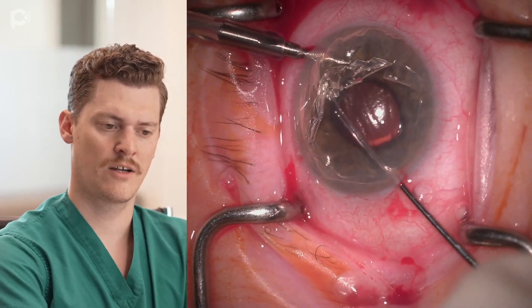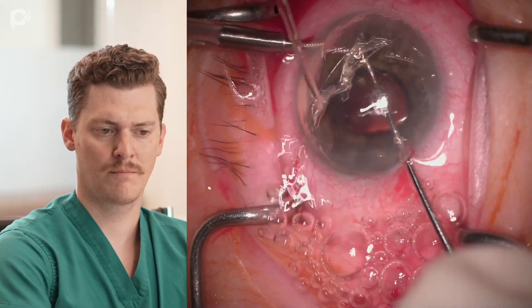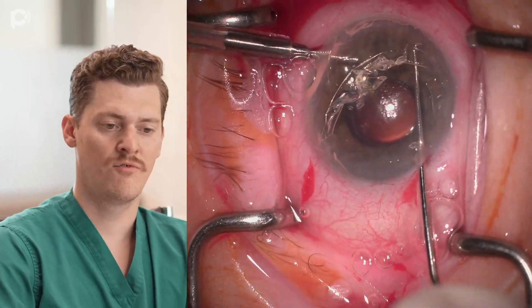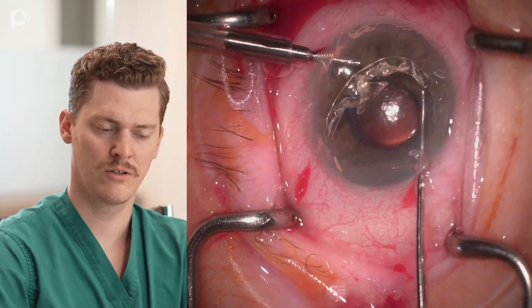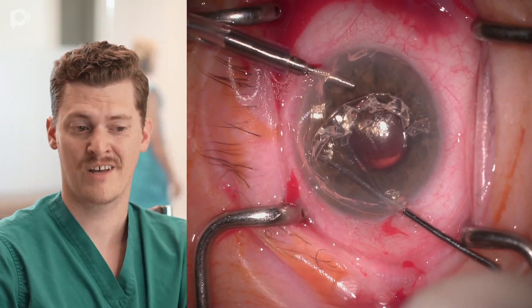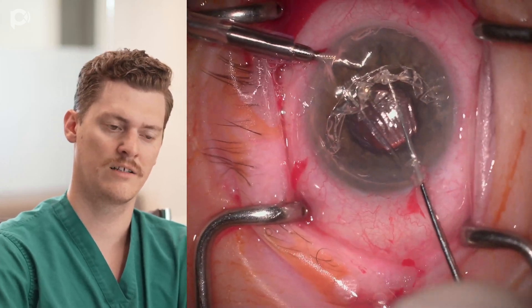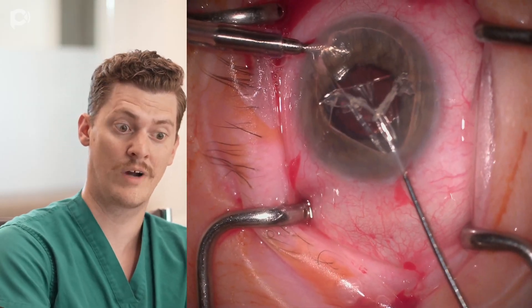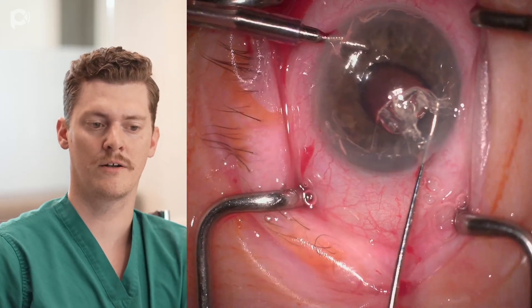As I'm moving around, you can see that I go really into the mid periphery, engage at the curve, and then pull towards the center. In this part, I'm grabbing at the apex of where the fold is and pulling towards the center. These movements should be very slow, controlled, and continuous. There are times where I'm really just picking at it and teasing the descemetorhexis — that's really not the best way of doing it. It's better to have slow, controlled movements because you're less likely to tear Descemet's membrane and more likely to peel it off in one piece. Here you can see me grab a good piece of it and slowly pull it all in one movement, stripping away much better than when I was teasing it.